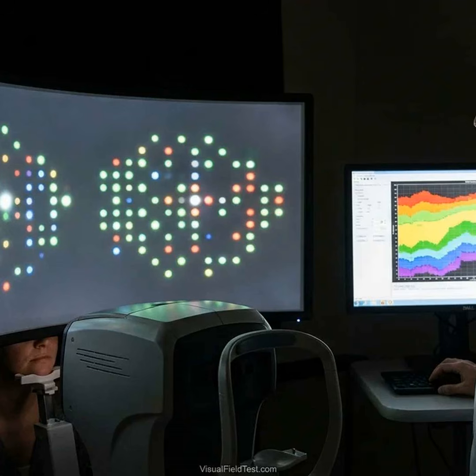Patient factors matter too. Good lens clarity is essential for color tests. Cataract can invalidate SWAP, so many protocols require lens grading or exclude advanced cataracts. Patients should be well rested and alert. Scheduling these exams at times of day when the patient is attentive can reduce fatigue.